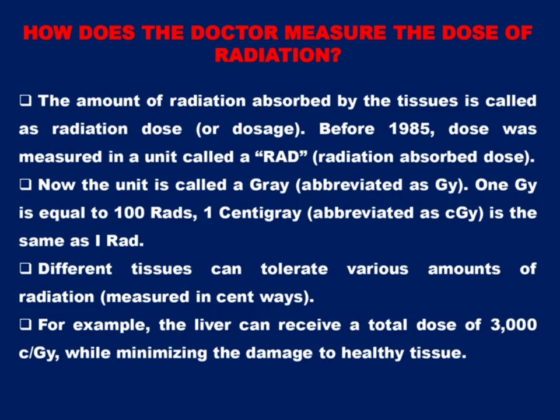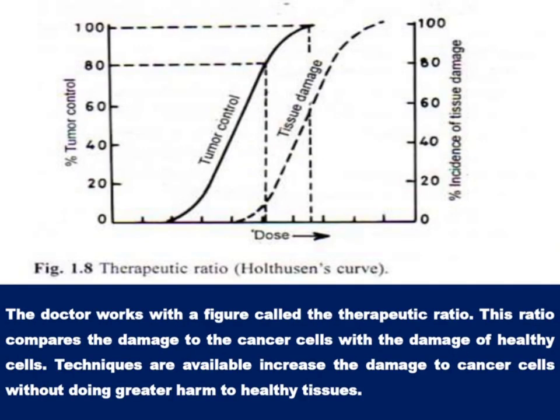For example, certain types of radiation can penetrate more deeply into the body than others. In addition, some types of radiation can be finely controlled and treat only a small area without damaging the nearby tissues. Other types of radiation are better for treating a larger area. So with different radiation, surface tumors can be better treated with electron treatment.